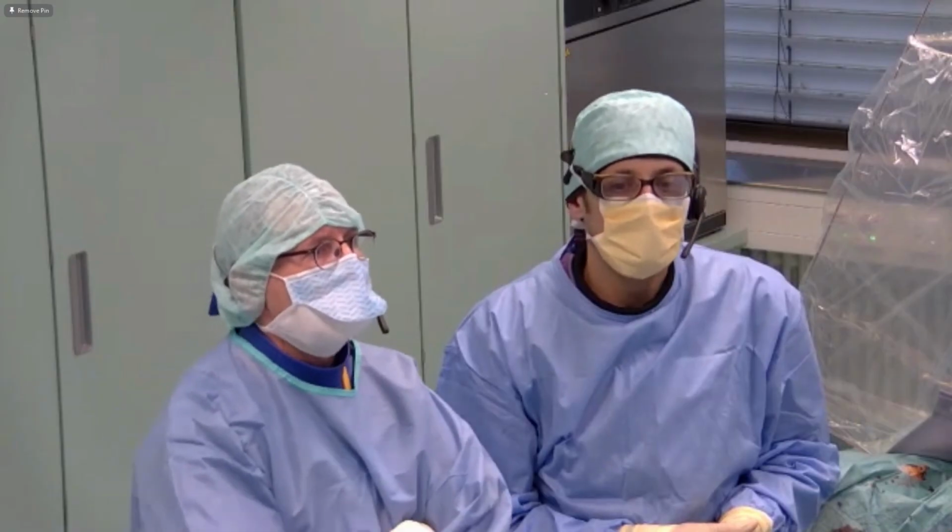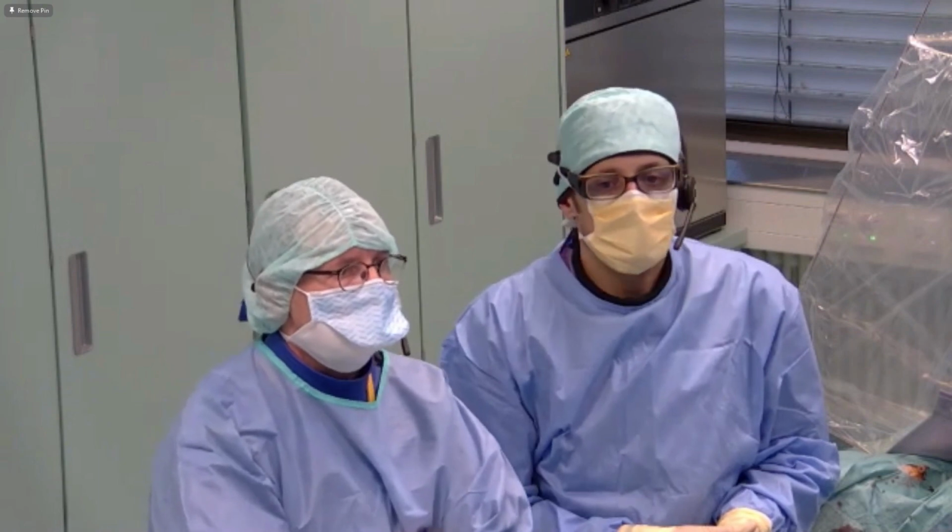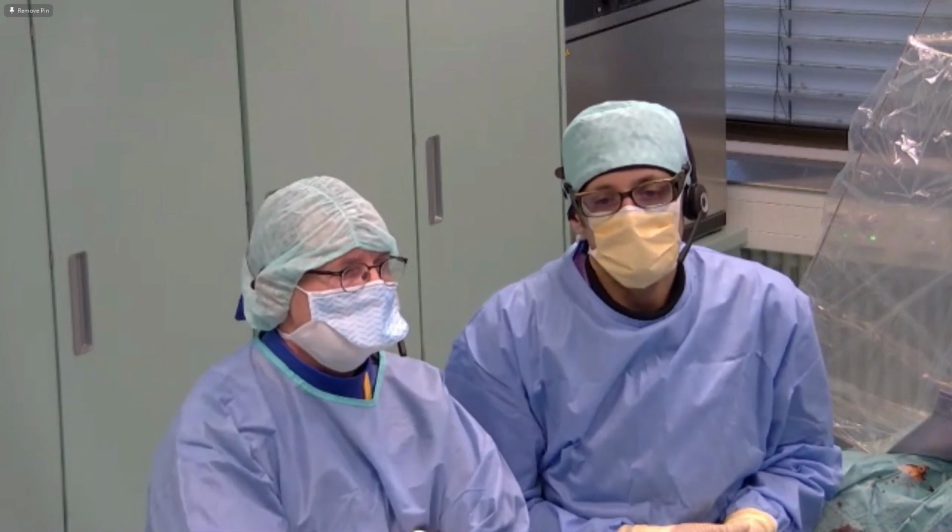Well, we have just to keep in mind that it is at least possible, but in all PCIs there can be ischemic events, and this is a little bit different, right? And for sure, like every cath lab, we have our defibrillator in place, but it's a very, very, very rare scenario. Therefore, I think every cath lab is able to treat it immediately.